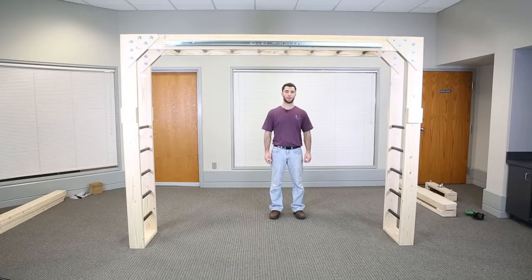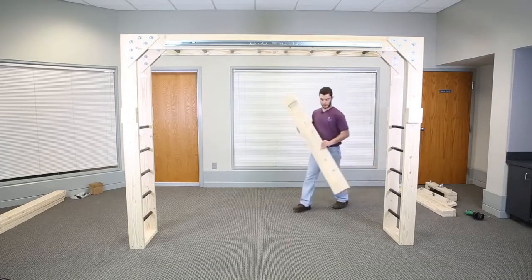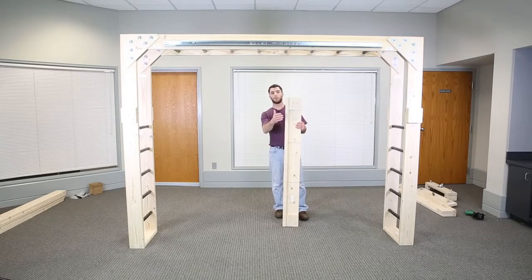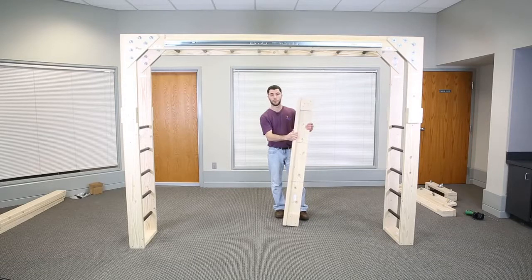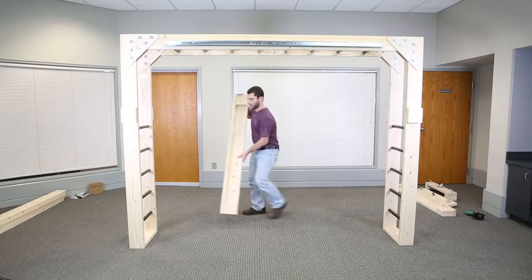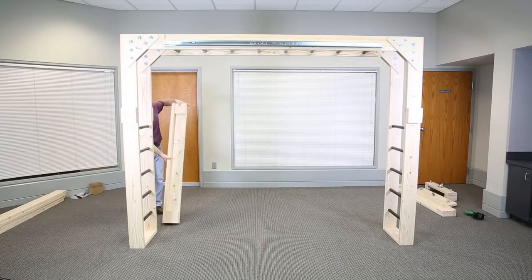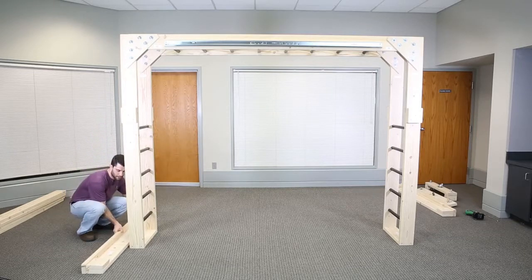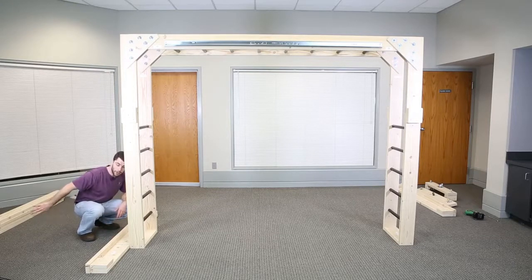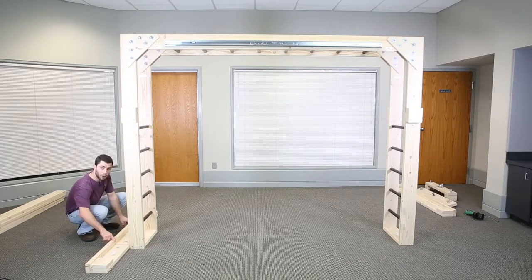Once your gym is standing upright, you can attach the bases. Each base is labeled base A and base B. The raised part of the base, in this case the 2x4, is the back side or the outside. So I'm going to match base B with the ladder B label. I'm going to place the base up against the back of the ladder with the back side of the base facing away from the gym. Also lining up the outside edges of the ladder with the dark lines on the base.